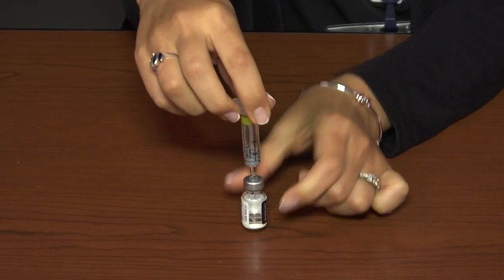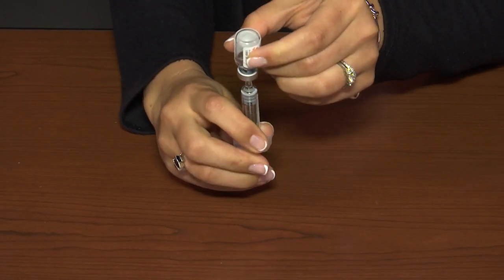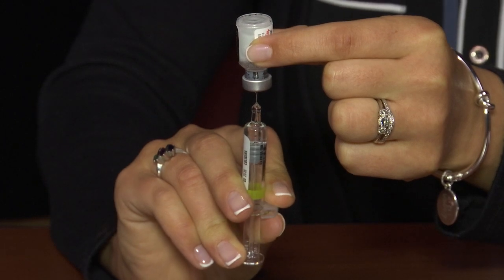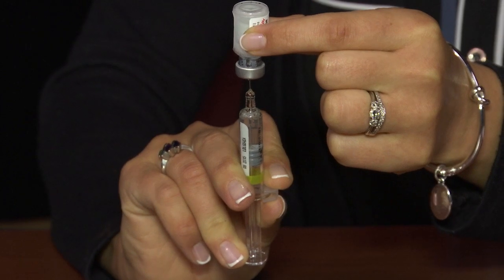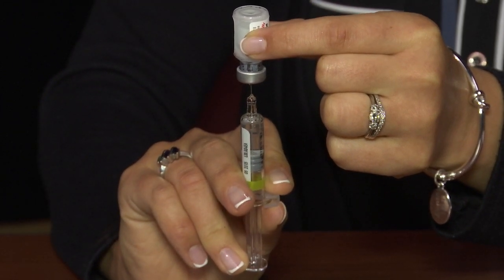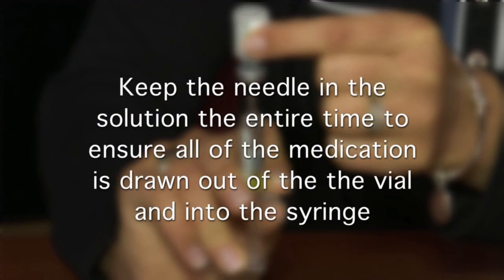When the solution is thoroughly mixed, turn the vial upside down, move it up to the end of the needle, and draw the solution out and into the syringe. Make sure to keep the needle in the solution the entire time to ensure all of the medication is drawn out of the vial and into the syringe.